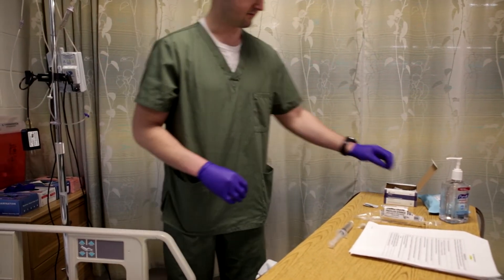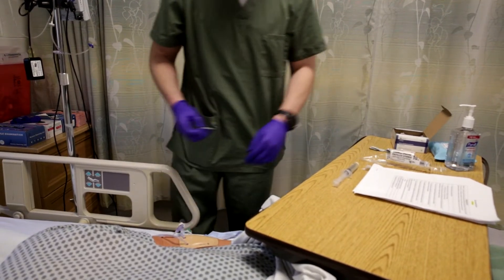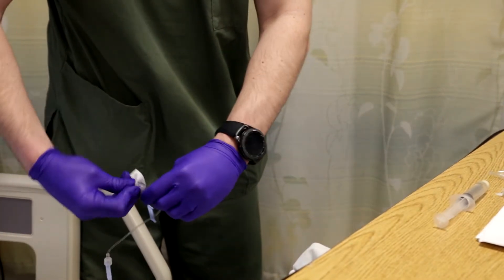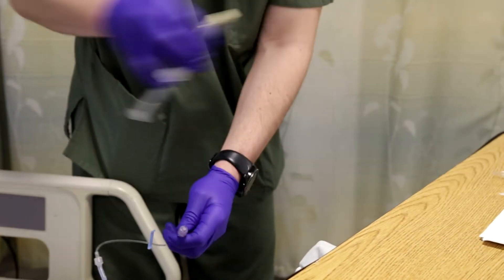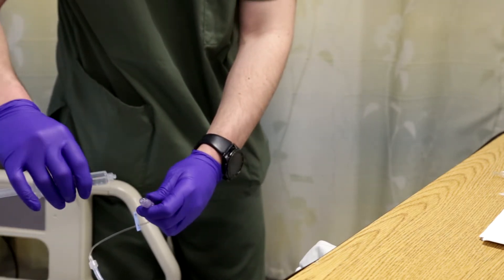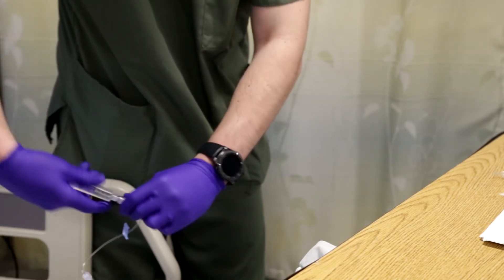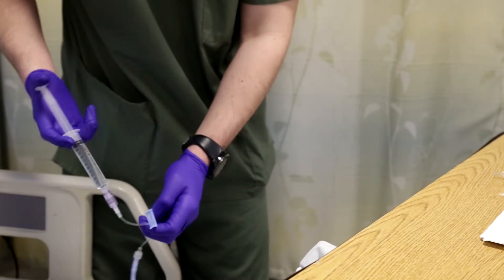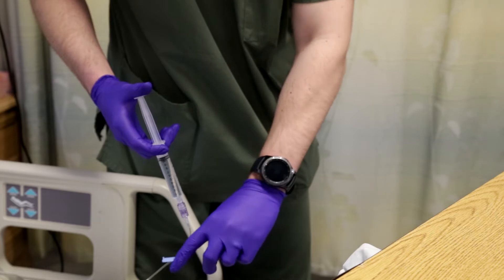Before I flush, I need to scrub the hub. I'm going to get my alcohol wipe. You can do this for 30 seconds, making sure to get all around it. Without letting go of my site, I'm going to take my flush, put it in my pinky, and grab like that. I already got the air bubbles out of this. Connect it — now I can push. If you're meeting any resistance, make sure that it's unclamped. I don't have any resistance on there.